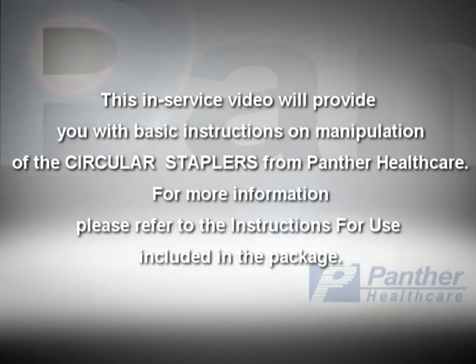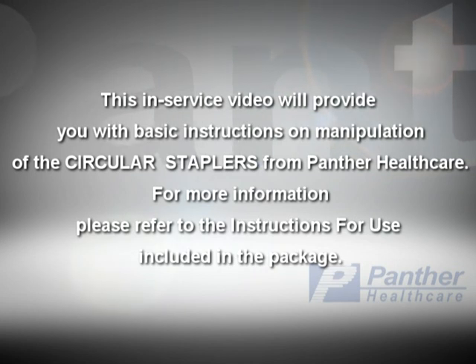This in-service video will provide you with basic instructions on manipulation of the circular staplers from Panther Healthcare. For more information, please refer to the instructions for use included in the package.